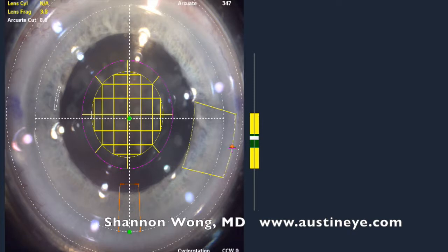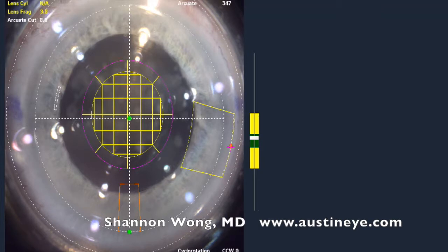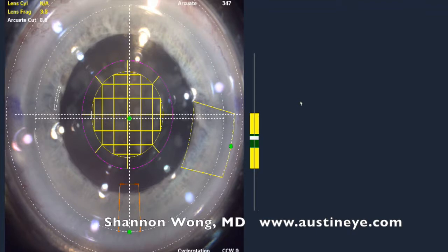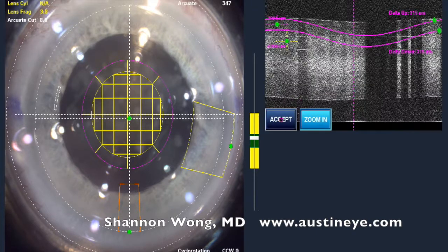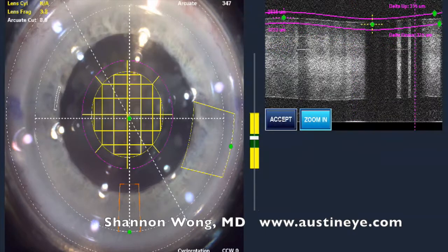This is the patient's second eye that is receiving laser cataract surgery. We did the first eye a week earlier and the visual outcome was excellent, so the patient and I decided to proceed with LensX laser cataract surgery to the second eye.